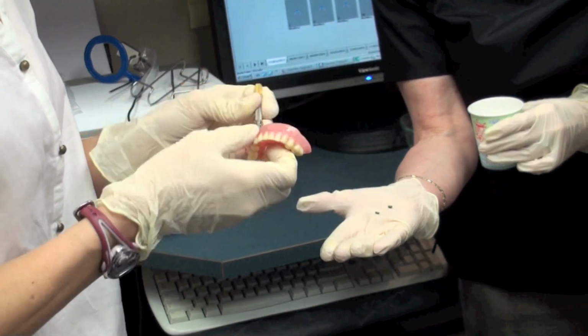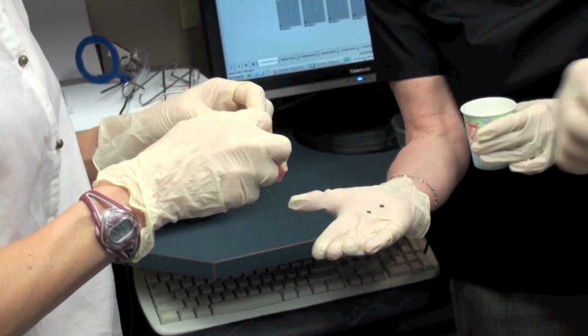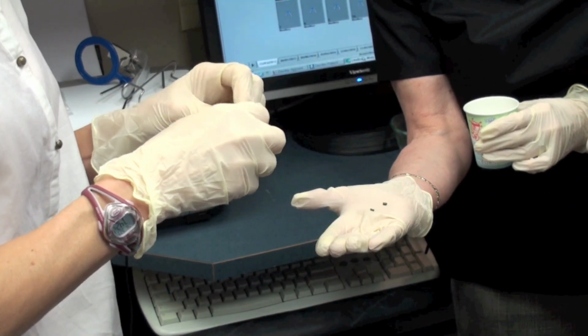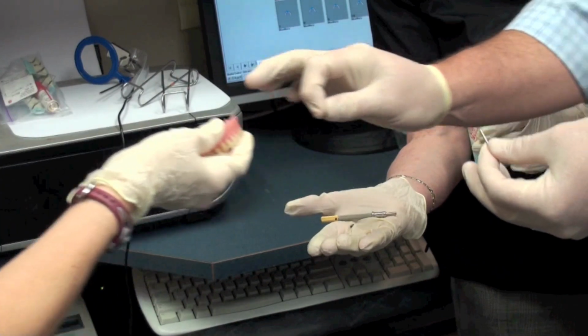Once you have it in, it's not easy. No, it's easy. But if you don't unscrew it 3 turns, it's not going to work properly. And you have to hold it. Okay? Thank you very much. So we'll put it back in one more time, so you can try.